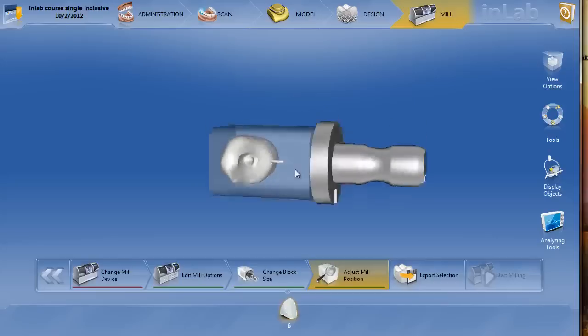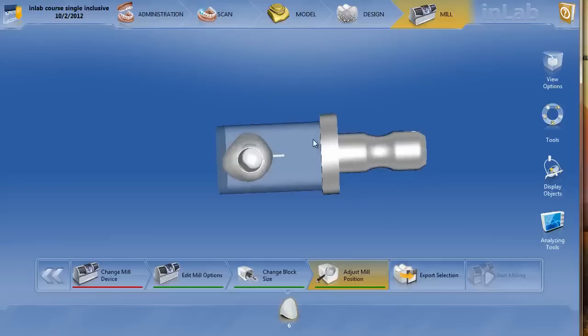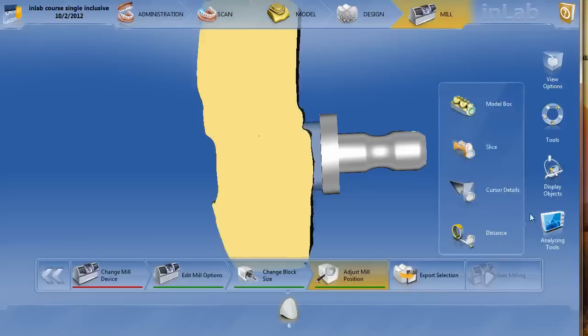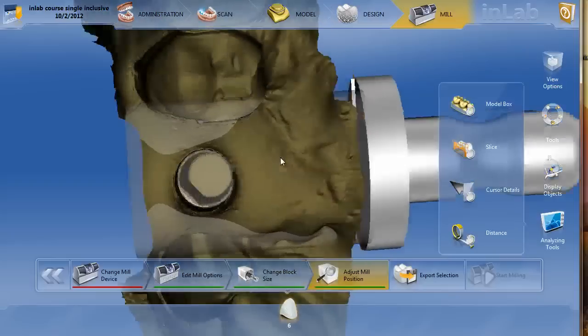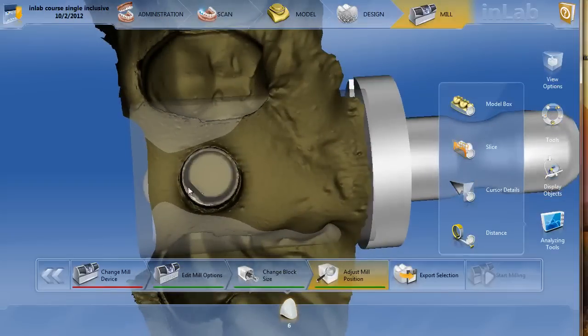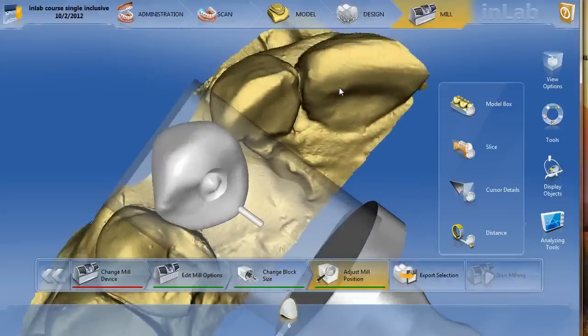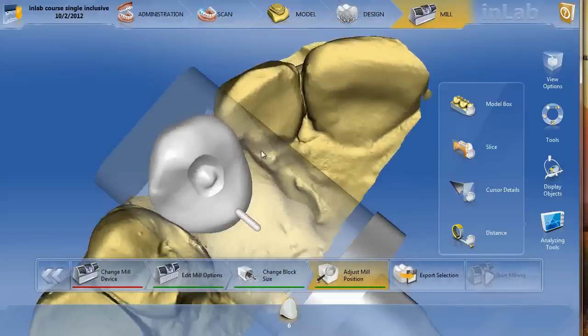When you go ahead and try to seat this on your Glidewell titanium base, it's most definitely going to bind right at where it meets the titanium base — it's just too long and too parallel. You can check with the model box, but trust me, in this case it binded up towards the top. However, once you take your burr and drill through to make sure your driver fits through there, it's going to seat all the way. If you get worried that it doesn't seat right away, just make your screw access hole and it will seat. That's how I would use the Glidewell titanium base system to make temporary crowns and a permanent screw retain crown.